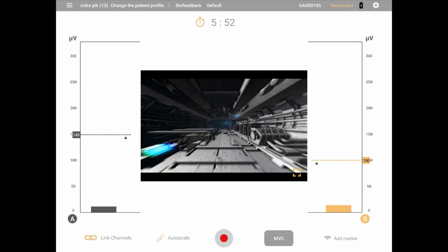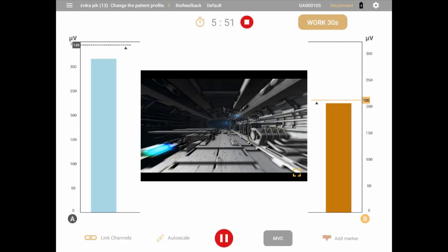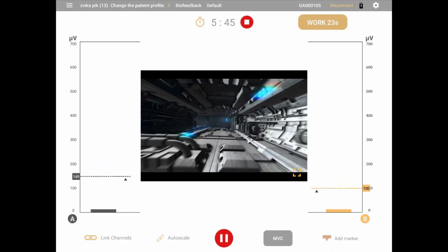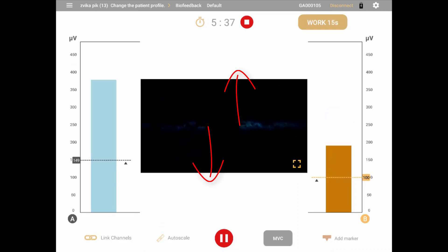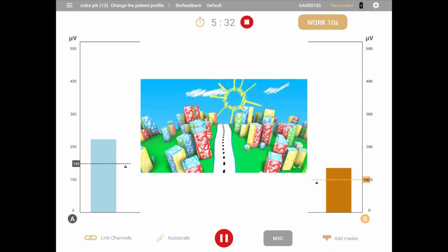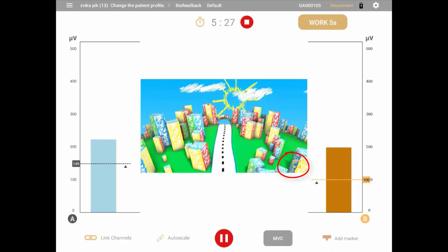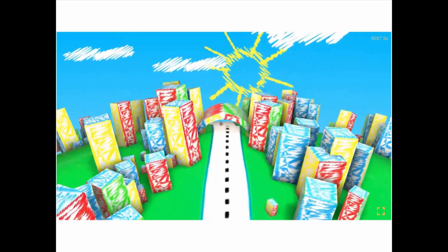After starting a session, this animation will play as long as the patient remains in condition and pause when conditions are not met. On this screen there are two more view settings: swipe up and down on the animation screen itself to cycle between four types of animations. You may also play the animation on full screen by clicking the screen icon on the bottom right of the animation window. To exit from full screen, click the screen icon again.